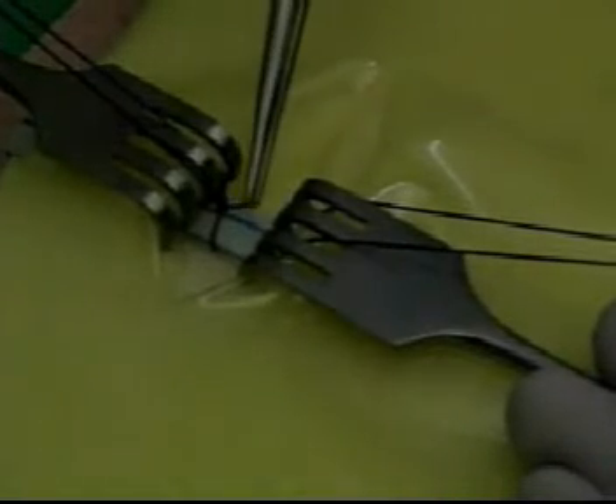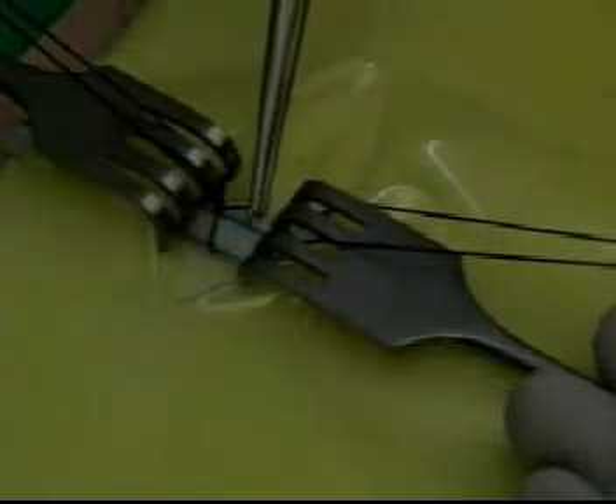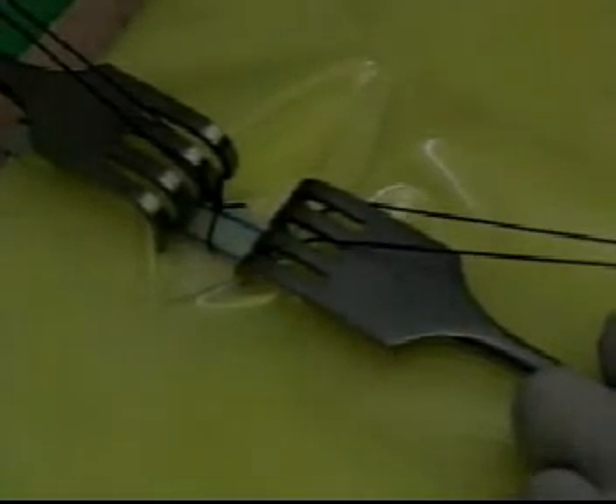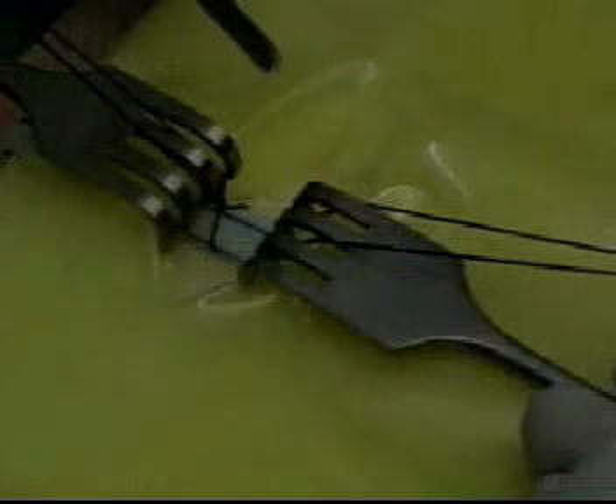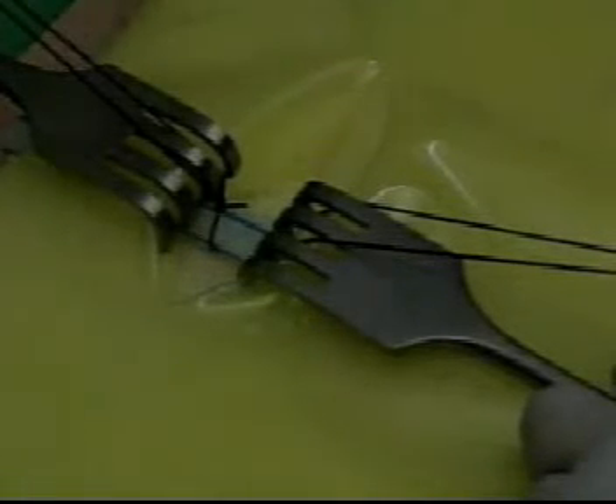Now with the help of a number 11 blade, a small incision is made in the wall of the vein. The incision should be made carefully so as to just pierce the anterior wall and not the posterior wall.